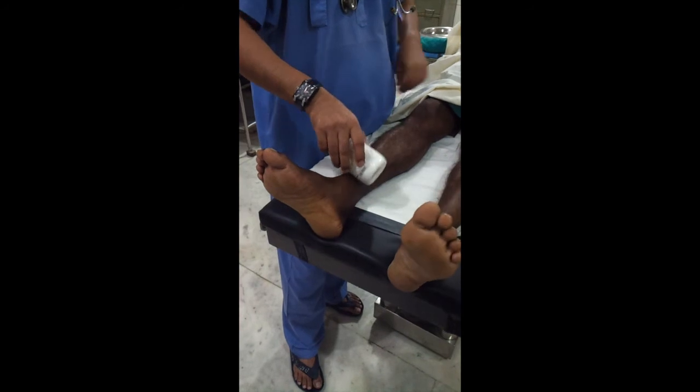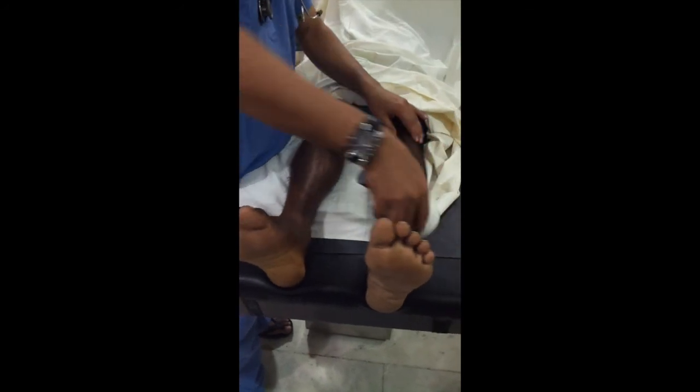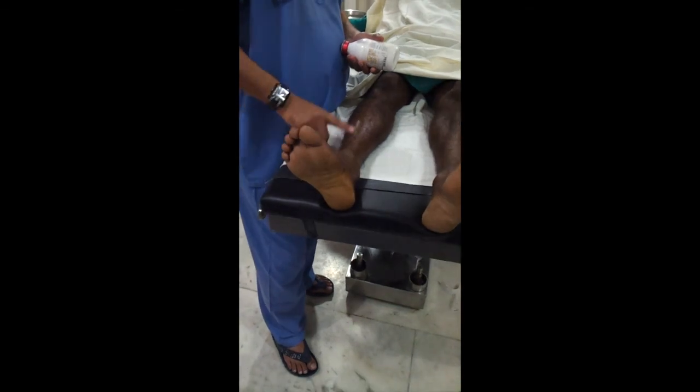Not feeling any cold sensation on this side. This limb is anesthetized.